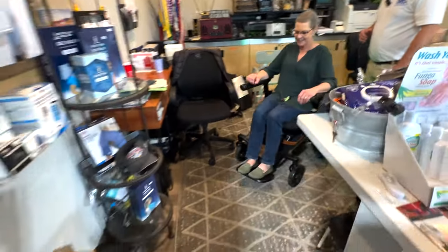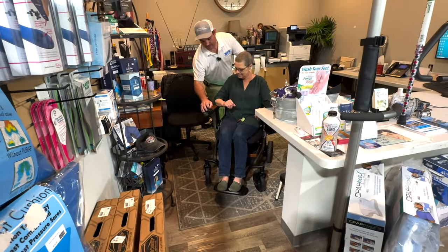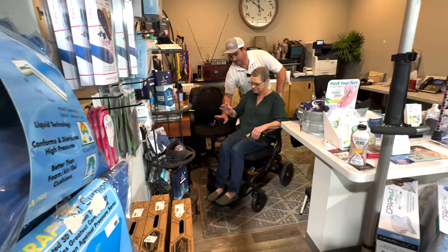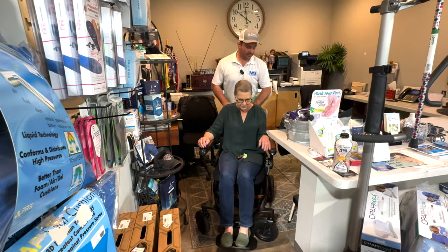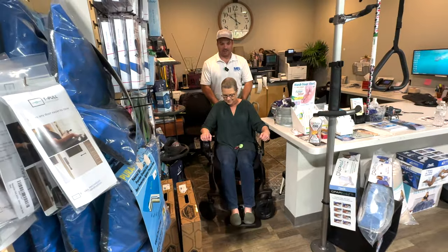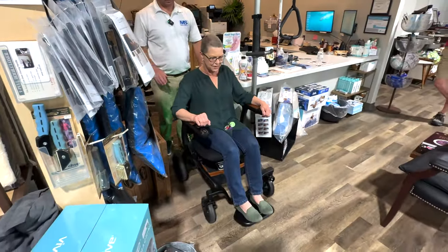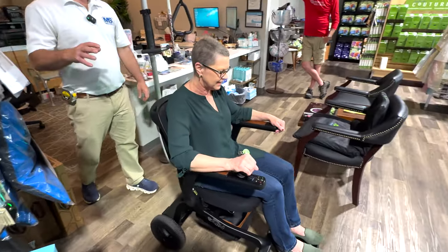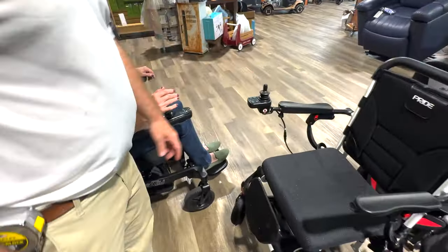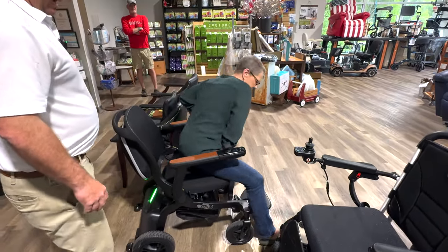You want me to slow it down? Now, I'm sure this can be programmable. This is really tight through here. Definitely, I'll get you going. You can do it if you mess up. Got to practice. Mary doesn't really drive these units. Is this your first time doing it? No, but this joystick, yeah. It's a palm style joystick compared to a top post like this. So it will take a second. Lock out.